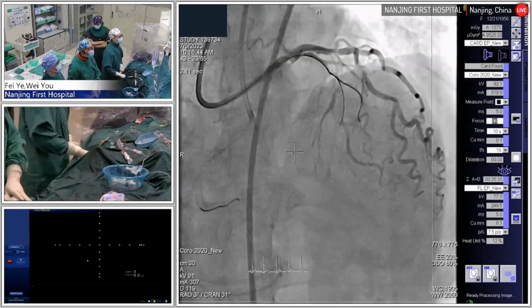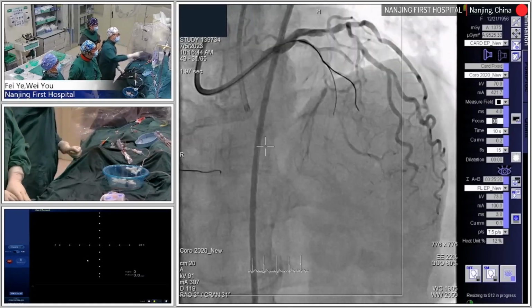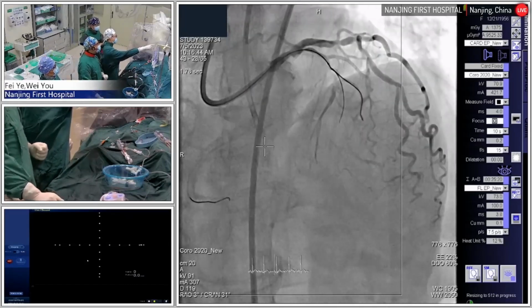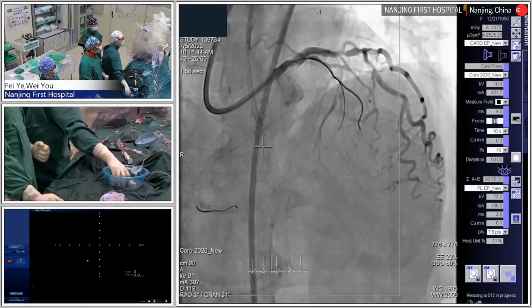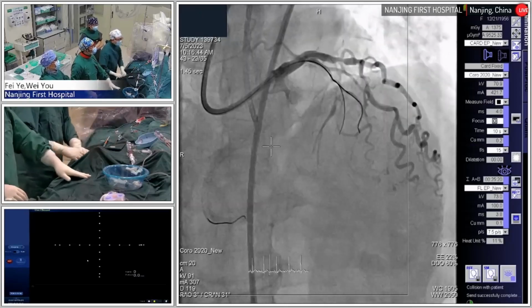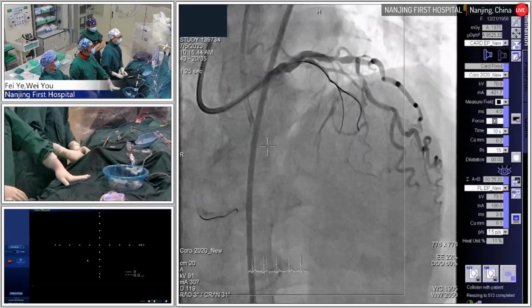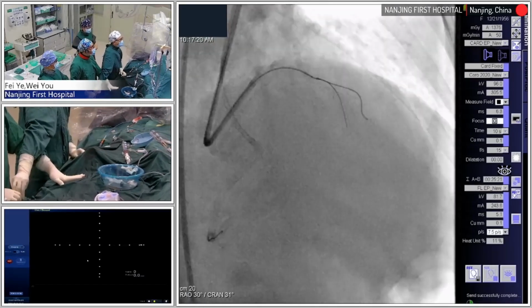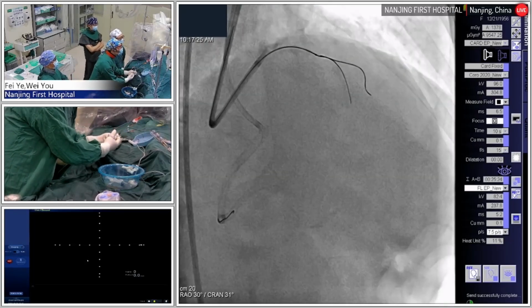Yes, two different angle views. So, Chief, from this projection, I just think it's different from the previous channel. I just want to go nearby the septal side. It's not in the... just because the wire just cannot change the y direction. Maybe parallel wire. That's why I want to use the parallel wire tactic, just because this wire can make the angulation.